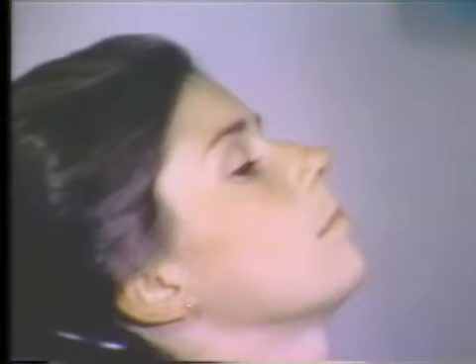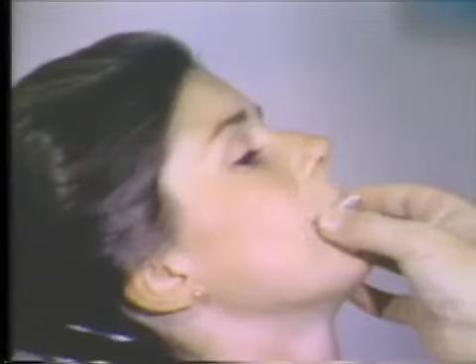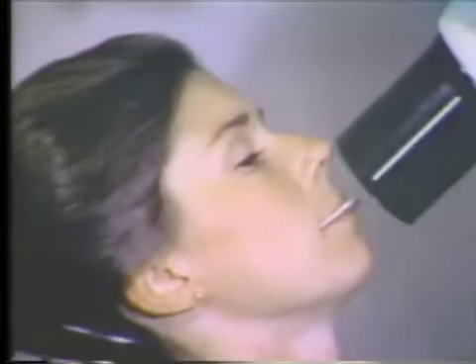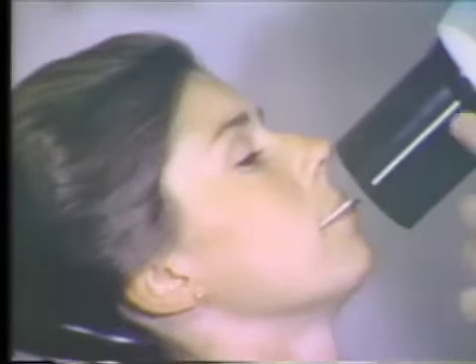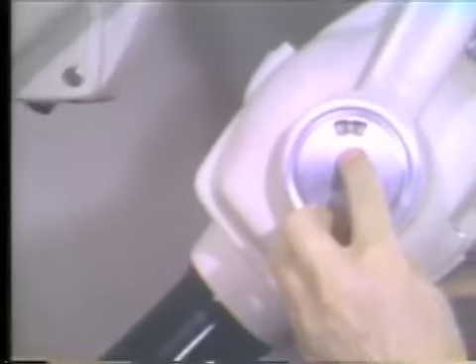Returning to our patient, again note the distinct backward tilt in which we have positioned her for this examination. The film is inserted as was demonstrated on the typodont. The correct vertical angulation for this particular position of her head is now determined in 2 steps. First, the white line of the X-ray cone is aligned with the lateral edge of the film packet.